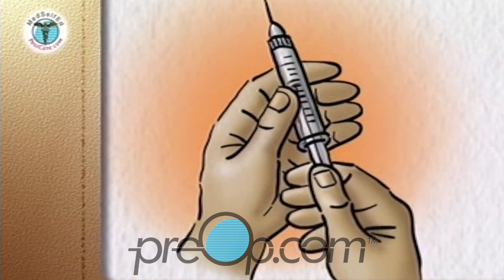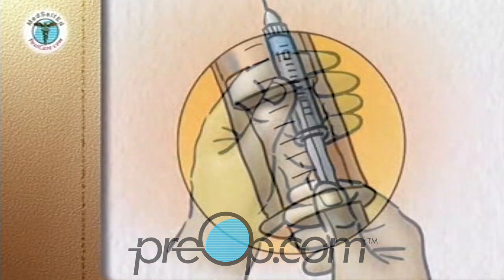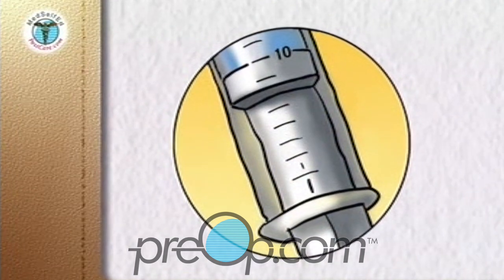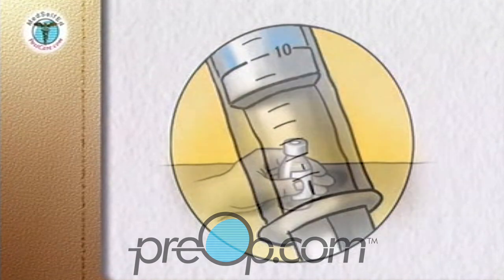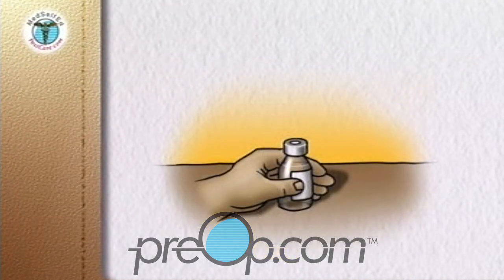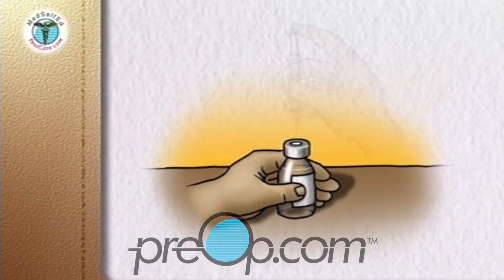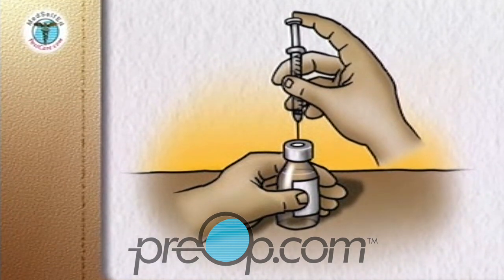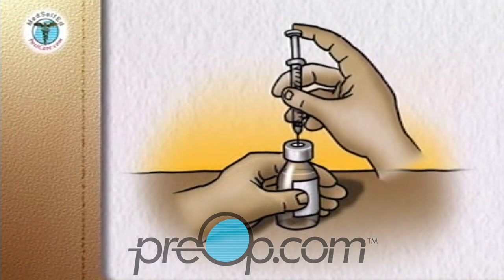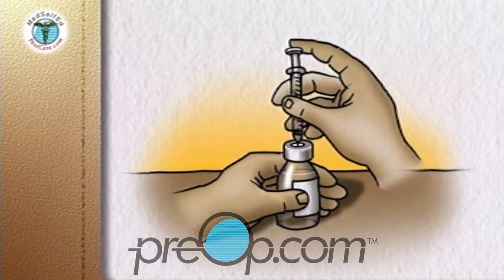Pull back the plunger of the syringe to the dose of the shorter-acting clear insulin — in this example, 10 units. You now have 10 units of air in the syringe. Check the insulin bottle to ensure you have the correct clear type of insulin. With the insulin bottle held firmly on a counter or tabletop, insert the needle through the rubber cap into the bottle. Push the plunger down so that the air goes from the syringe into the bottle.